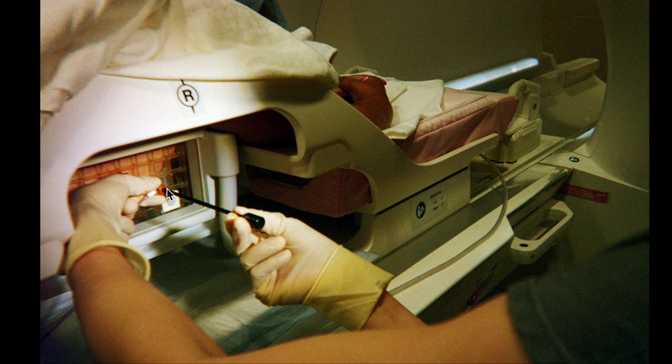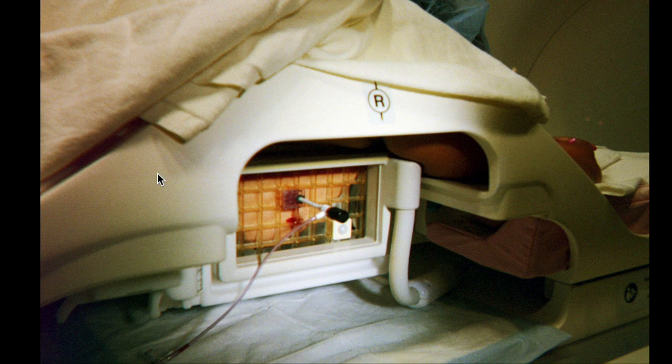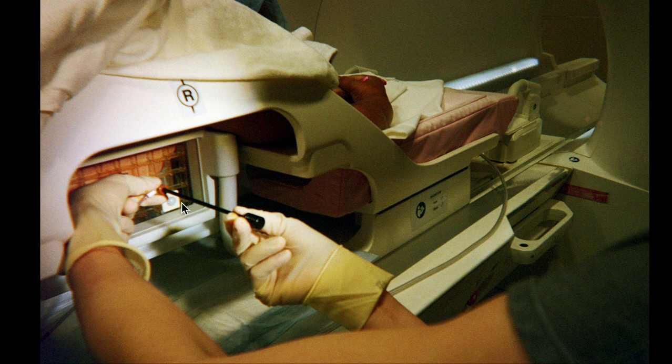And then after it's in, I pull the needle out and I put this blue device, which I will call the space holder, in. I don't leave the needle in while the patient's getting scanned. So I take the needle out, I put this blue space holder inside the introducer, so when the patient's getting scanned, she does not have a sharp needle in her.